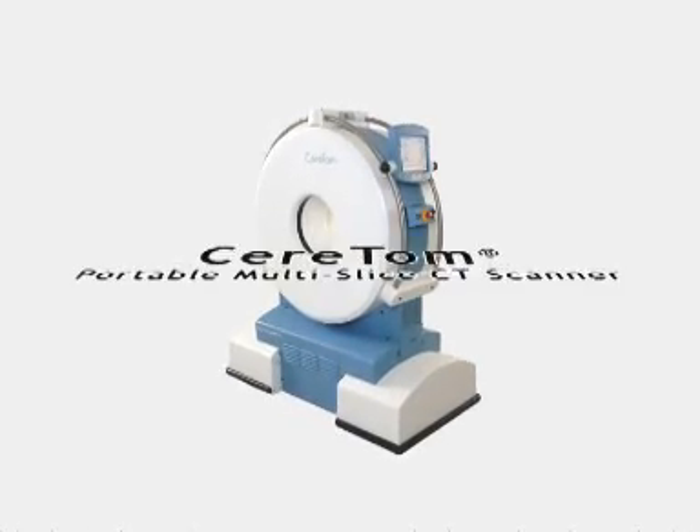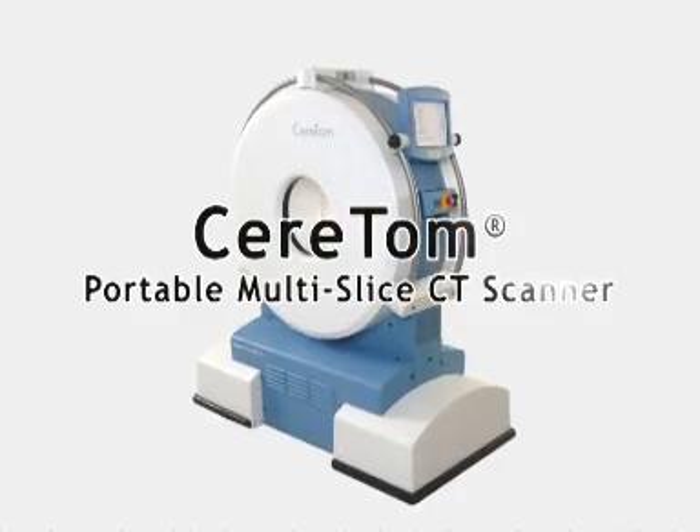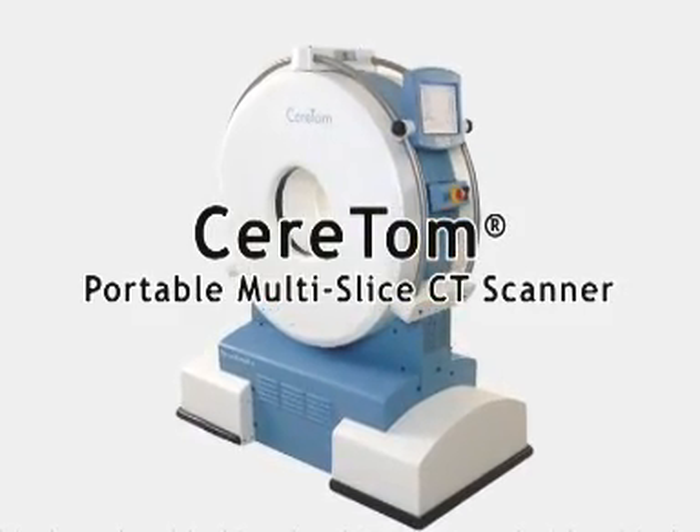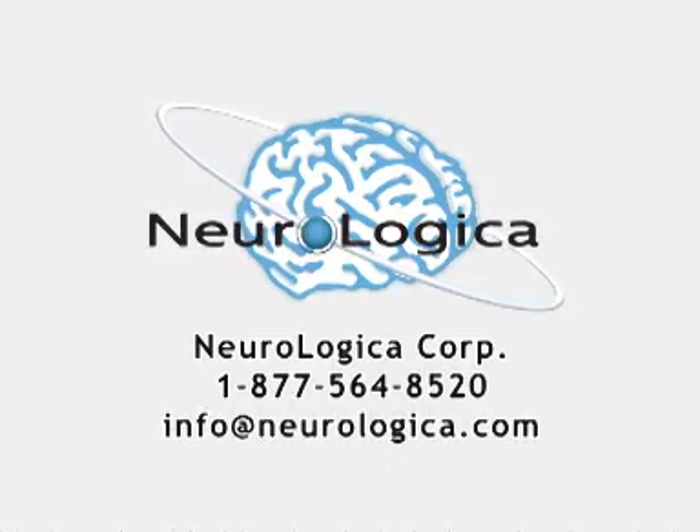This video is intended to demonstrate the ease of use and portability of the Ceratom Portable Multi-Slice CT Scanner in the ICU scenario. The Ceratom is developed and manufactured by Neurologica Corporation of Danvers, Massachusetts.